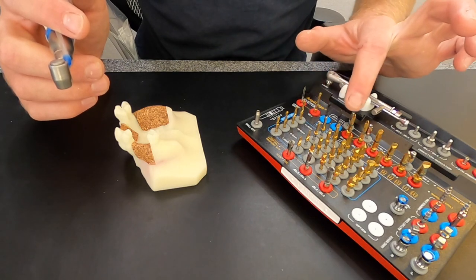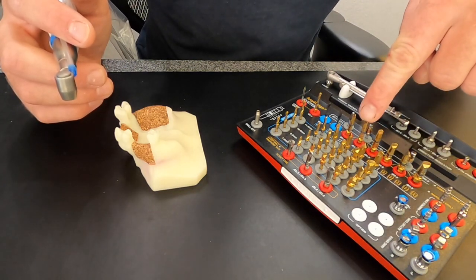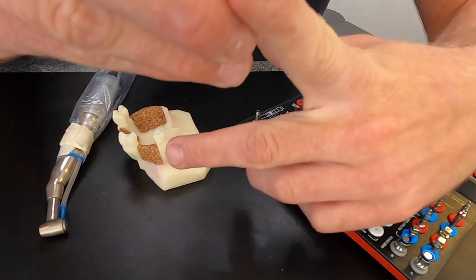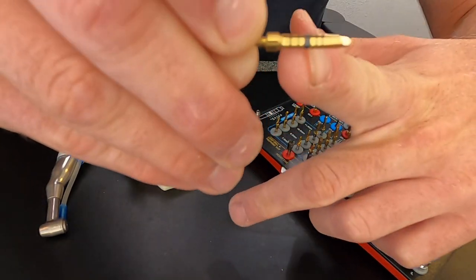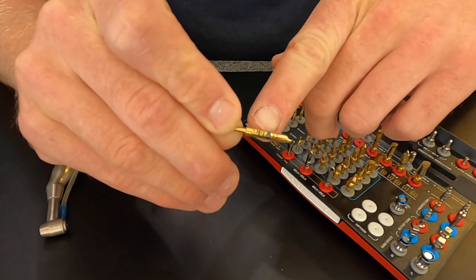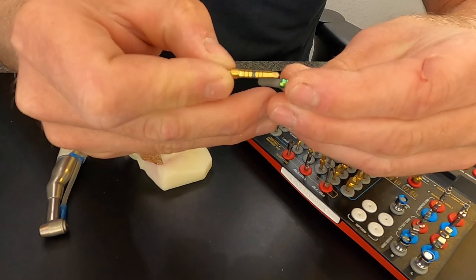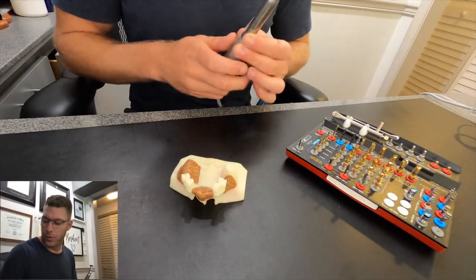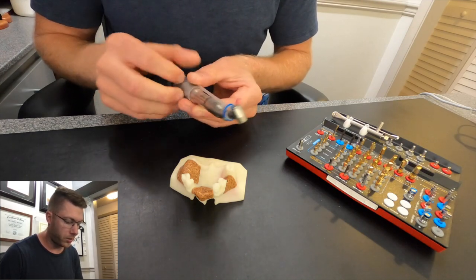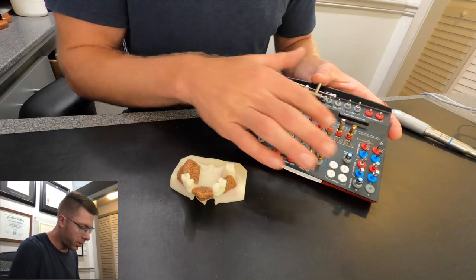I have a series of drill sizes that slowly go up to 6 millimeters. This particular implant is 3.9 millimeters by 10, so I have a 3.8 millimeter drill here, and I will be going up to the bottom of that dark line through the series of these drills to get to my implant depth. Now keep in mind I want to countersink this implant by about a millimeter, so I'm going to go up to the top of that dark line on this 3.8 millimeter, knowing that it is a 3.9. This is my surgical kit with a sequence of osteotomy burrs or drills.